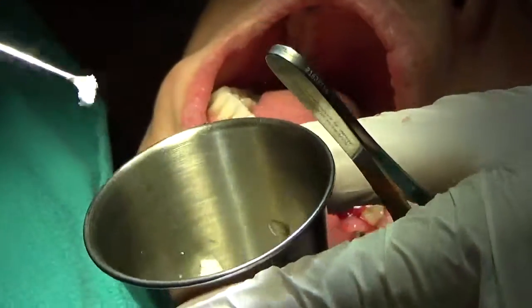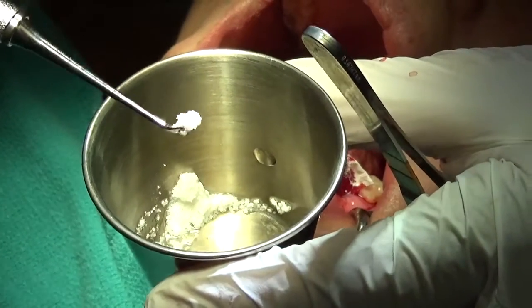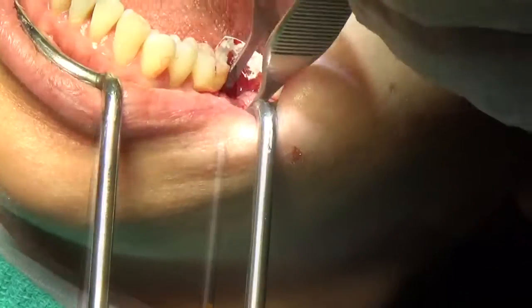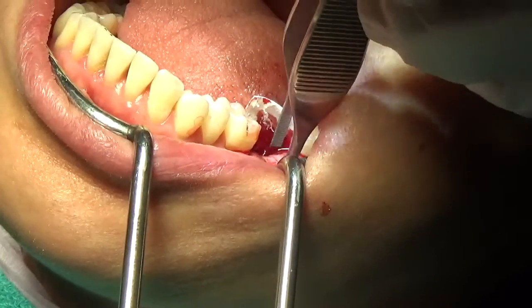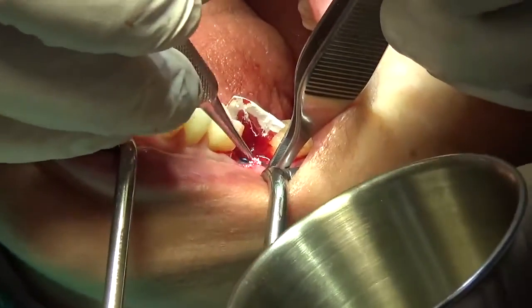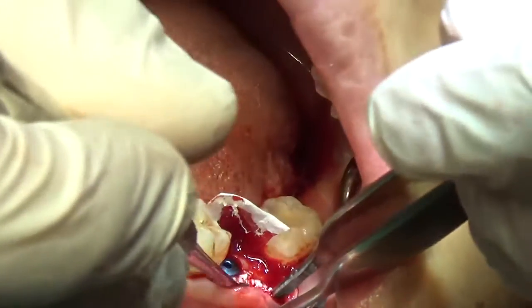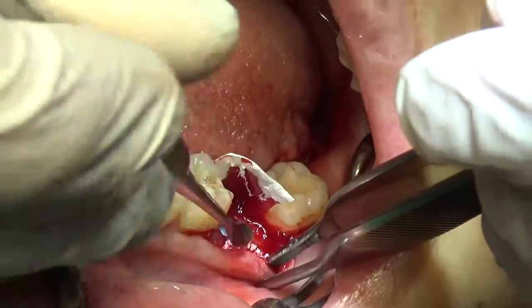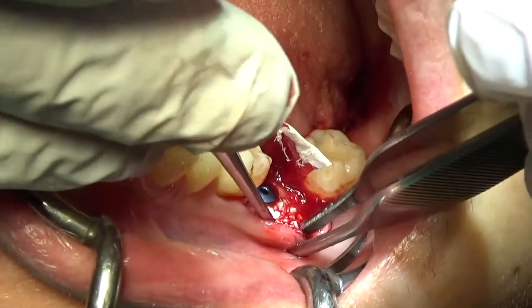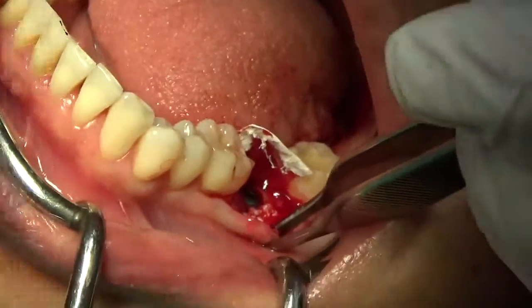And like Aldo showed, if I can move it around here and it's not falling off my instrument, it's a good consistency. Maybe that, would you mind? Pack this on the buccal aspect right onto our bleeding points and compress it straight onto the bone. So we know that this is going to resorb a little bit.